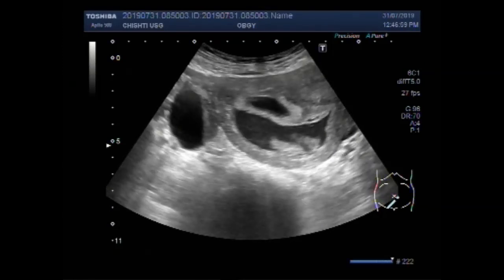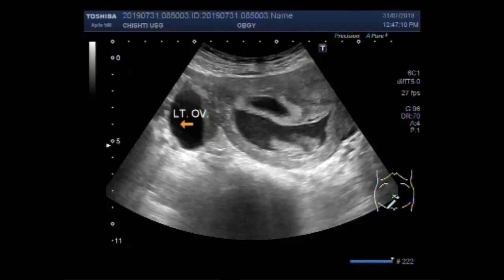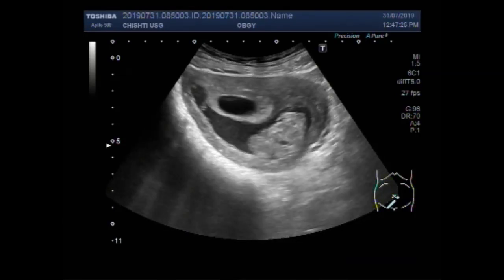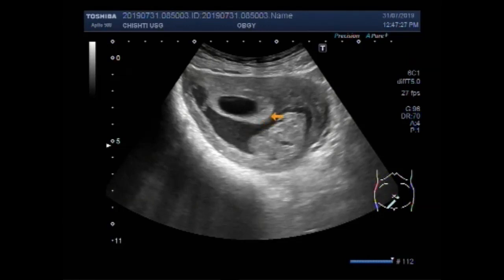Both of the fetuses are lying in separate gestational sacs, and this is a left ovarian cyst. Now you can see two separate gestational sacs in the uterus.